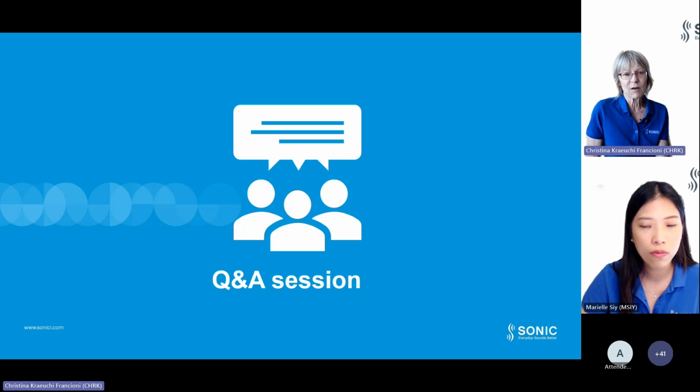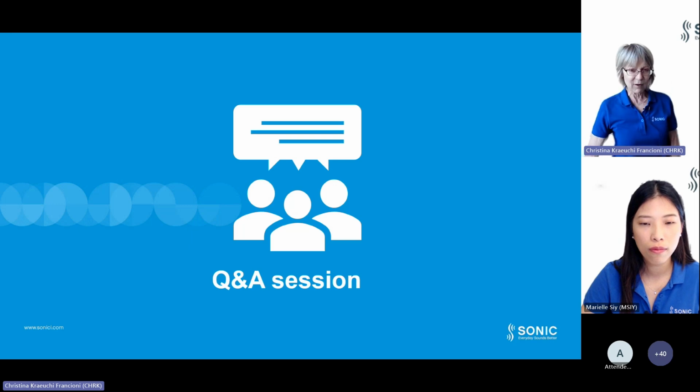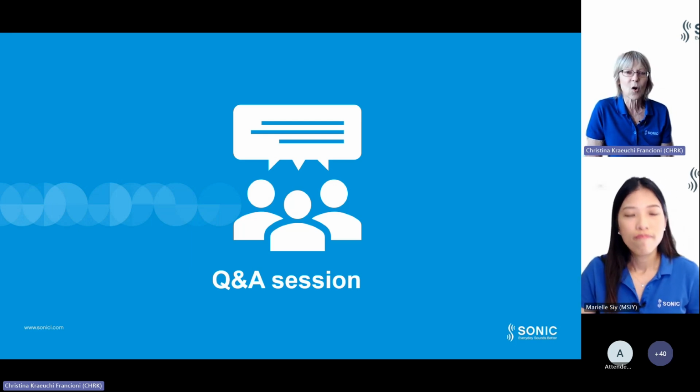Yes, because in the accessory menu, we can not only increase the volume of an incoming call, but we can also decrease the level of, for instance, the other side, or decrease the level of both microphones so that whenever a call comes in, the hearing aid user can really focus on the call.